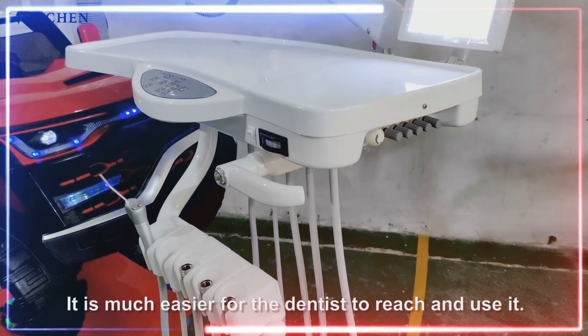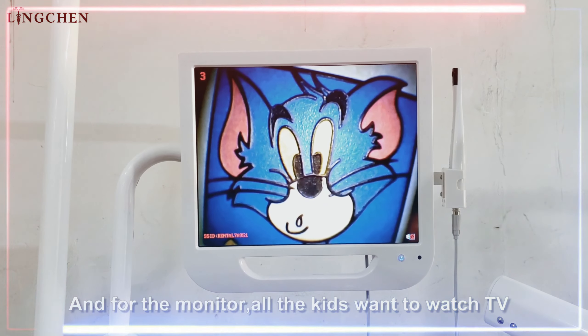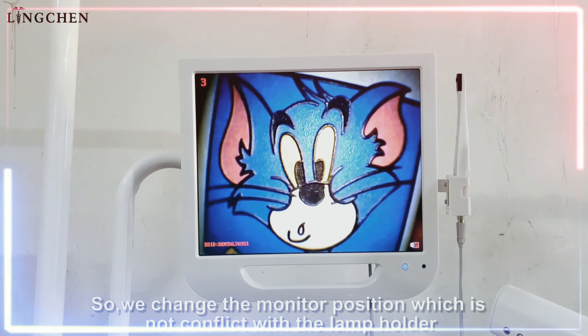It is much easier for the dentist to reach and use it. For the monitor, all the kids want to watch TV, so we changed the monitor position so it does not conflict with the lamp holder.